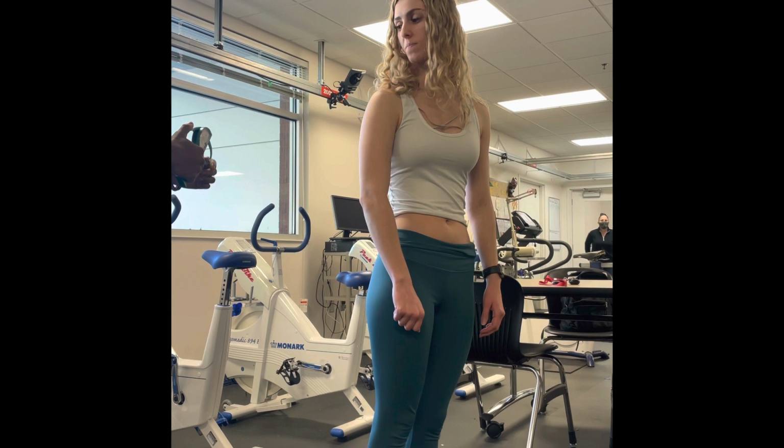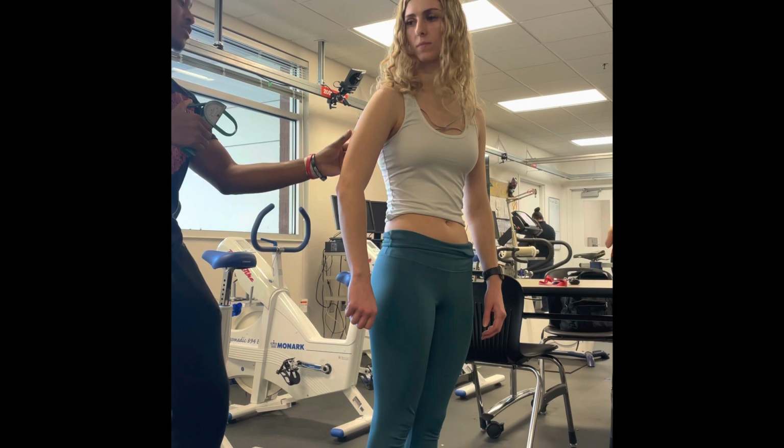Okay, so today we're going to do a skinfold caliper test on you. All right, so first we're going to start at the triceps. There's 3 sides we're going to have to do. It measures body fat percentage, okay? So we're going to start with the triceps. Might do a little pinch.